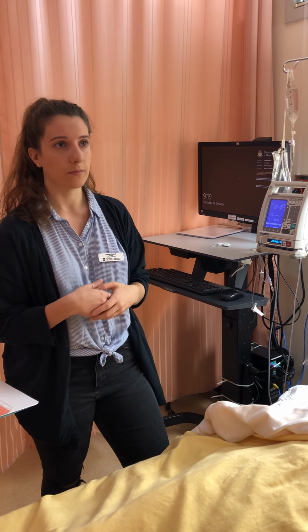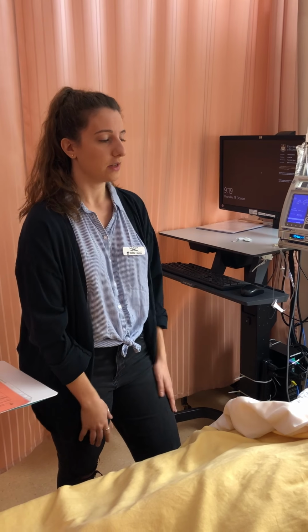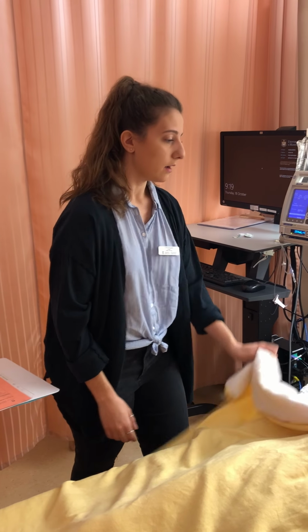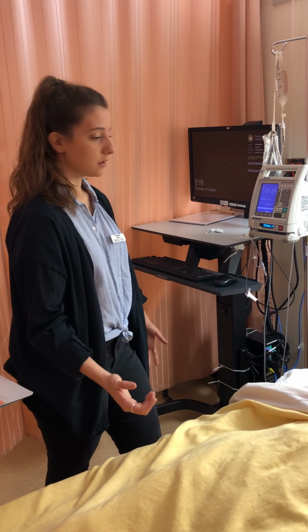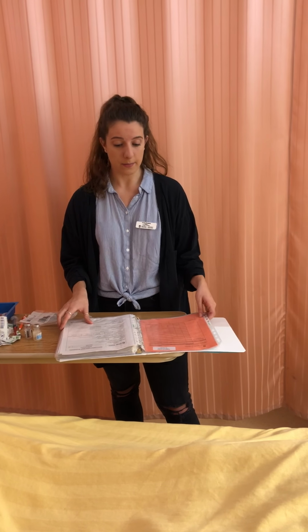I might also monitor for about 5 minutes, just because this is the first time that she's gotten the med, to make sure that no allergic reactions occur. I'll do my general survey out, and then I will come and do my documentation of the time and my initials.